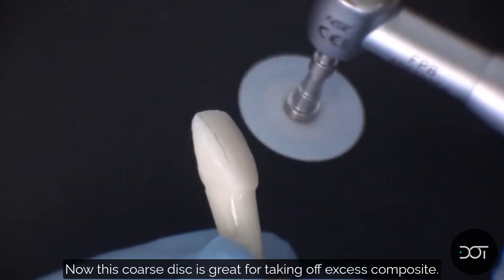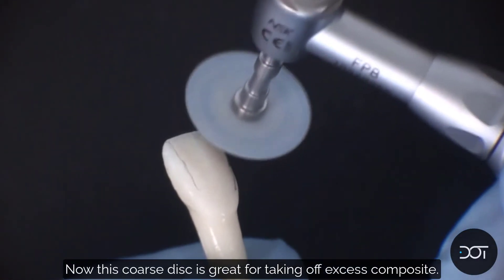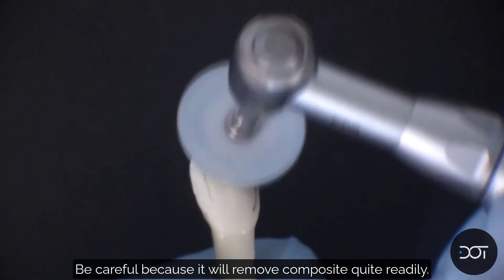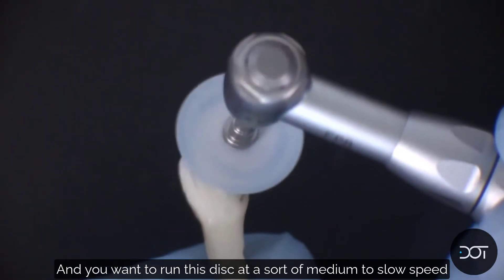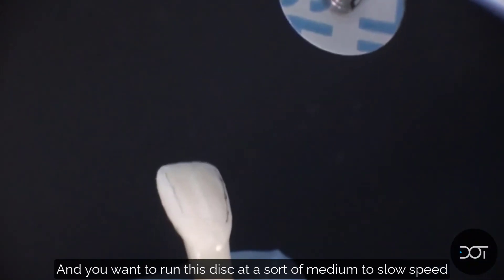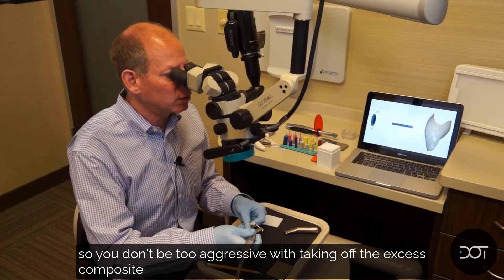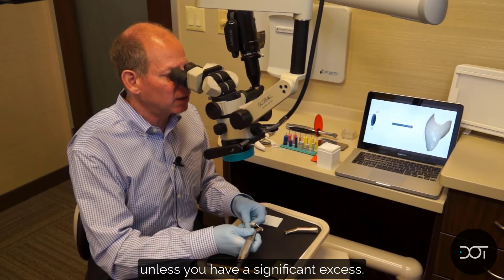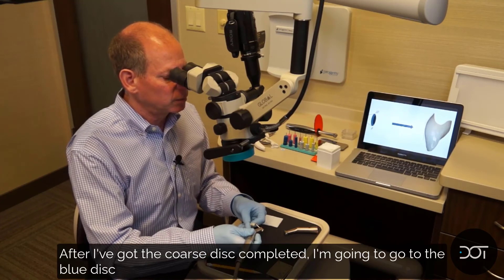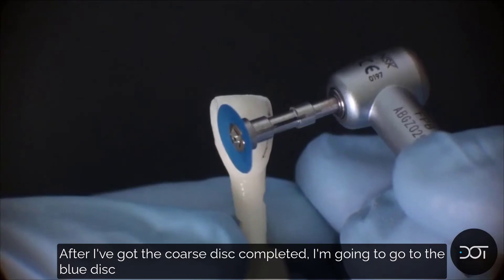This coarse disc is great for taking off excess composite. Be careful because it will remove composite quite readily, and you want to run this disc at a medium to slow speed so you don't be too aggressive with taking off the excess composite, unless you have a significant excess. After the coarse disc is completed, then I'm going to go to the blue disc.